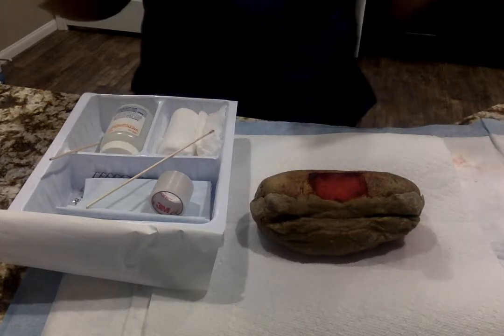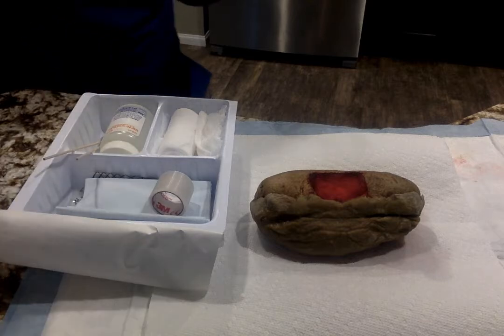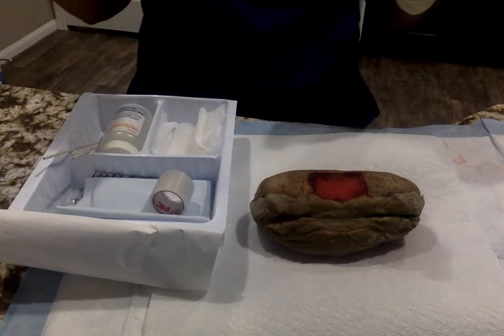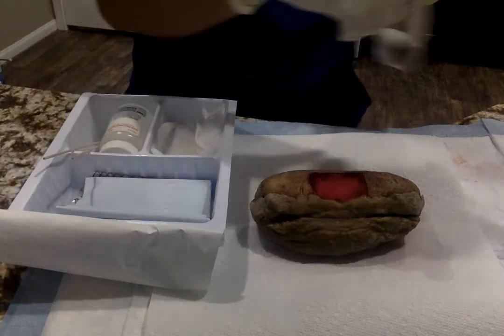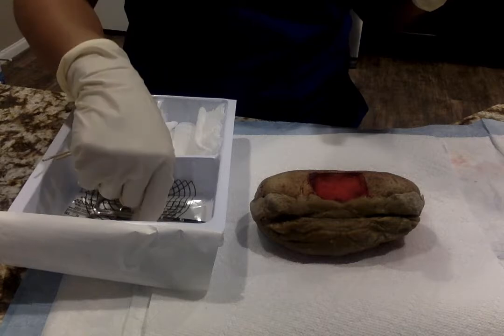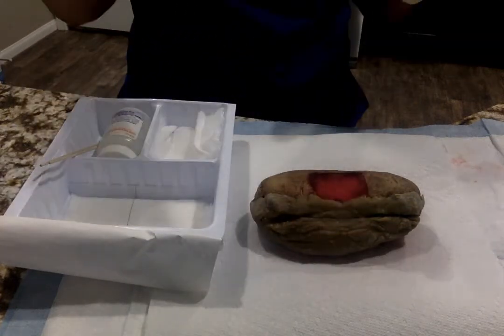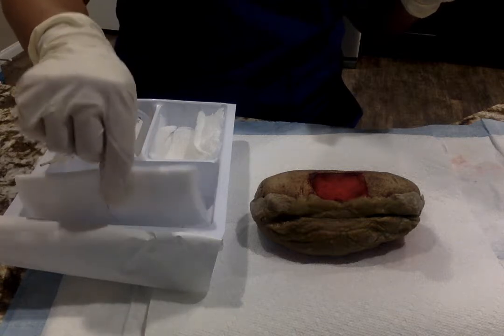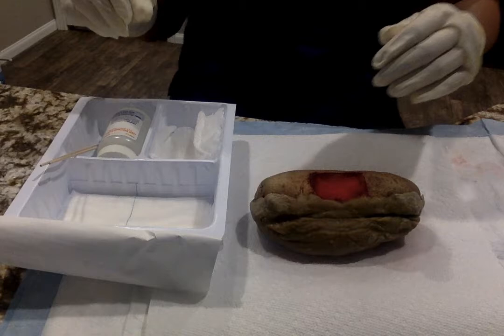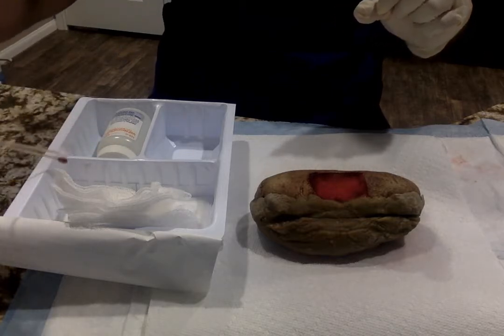Okay, so I'm going to go ahead and readjust my cotton tips without touching. I'm going to take out what I don't need, which is the rolled gauze. Throw that out. I'm going to throw out the tape for now because I can use that later. And I'm going to take out this extra padding. Don't need that. Scissors. Don't need that. Don't need my trash bag. I'm going to leave my ABD pad in here. I might not use it because my wound is smaller, but if the wound was bigger, I would use it. I'm going to move my 4x4s to the side, and move my cotton tip applicator right there.